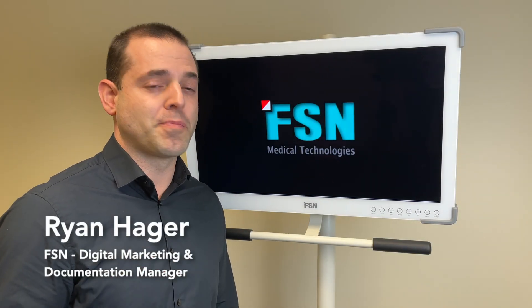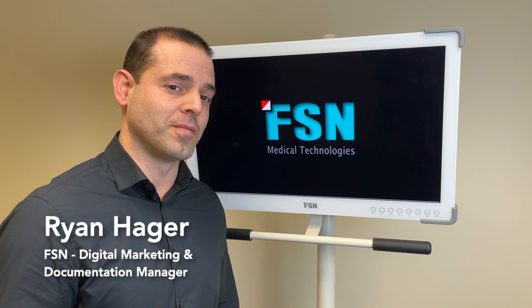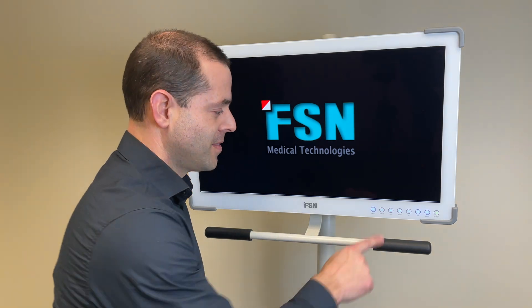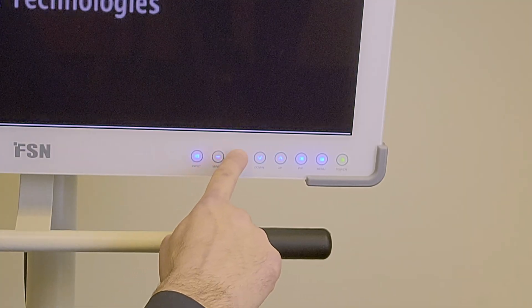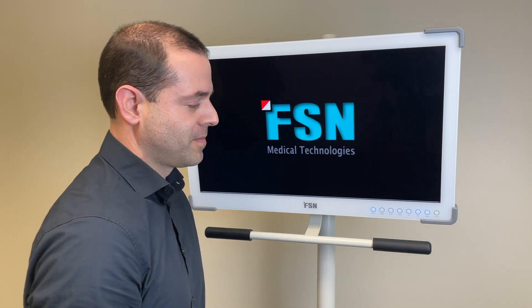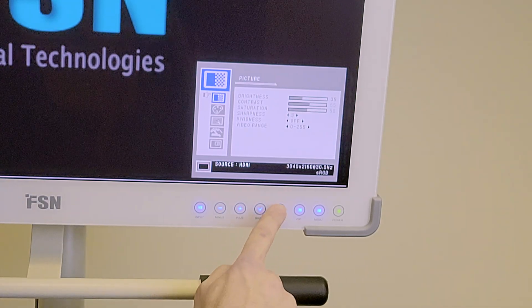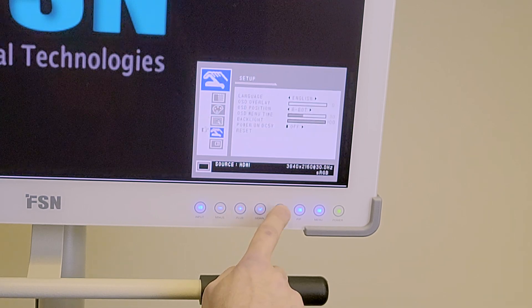FSN medical technology displays how to control them. First tip: poke them once to wake them up. Next you have minus, plus, down, and up. When you press menu you can now go down, you can go up.